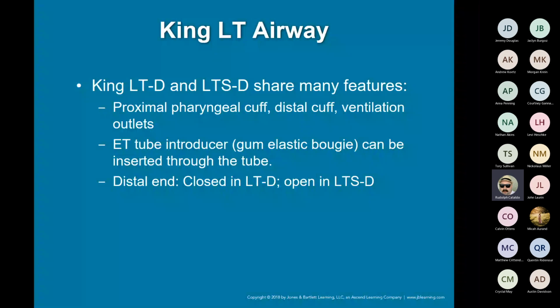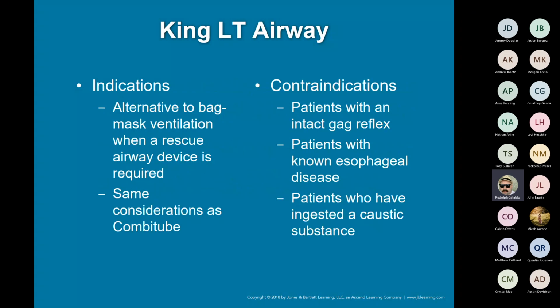I'm not going to cover all the different parts of a King. You guys should be familiar with those. Again, if I can't get an intubation, I go right to a King. There's no sense in me letting ego and pride get in the way of patient care, where I say, oh, I've got to get this intubation. No, just fall back to something simple.